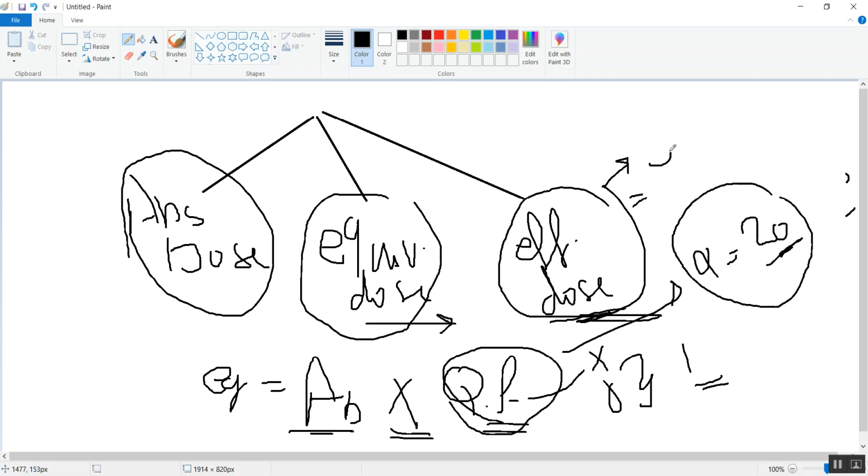So the effective dose will be the equivalent dose times what? Times tissue weighting factor, WT, which is related to different types of organs inside our bodies. Okay, so the effective dose is the third term.